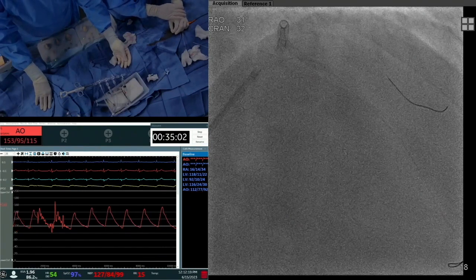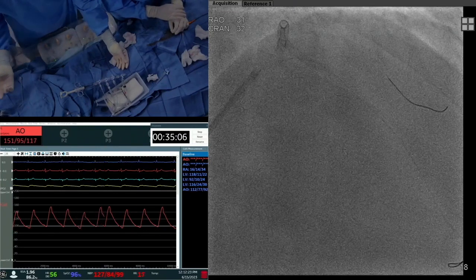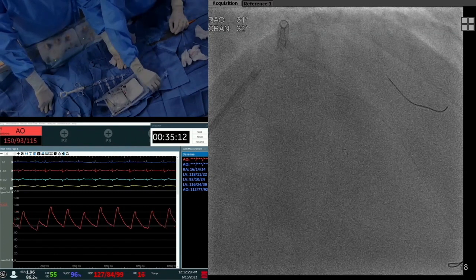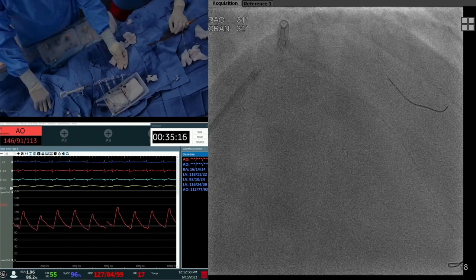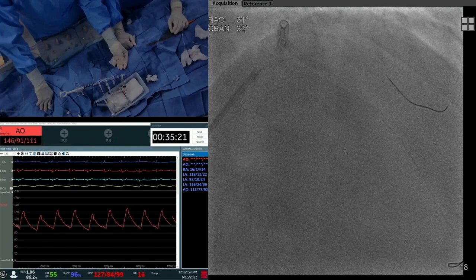Remember, if it is bigger size, we would say DK crush. Yeah, but why not 2.5 and DK crush? Tell me why you're not doing DK crush. It's up to the operator. If somebody says they want to do mini crush, DK crush, same. Yes, go ahead, do DK crush. But I'm so comfortable with mini crush. Will I do DK crush? Yes, a few more steps extra. So I would not want to do that, but I agree with that.